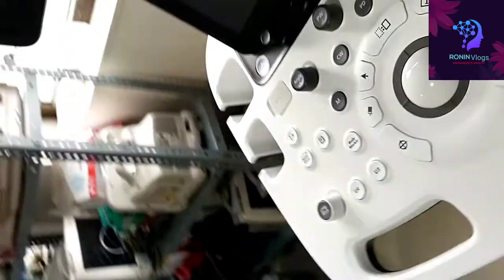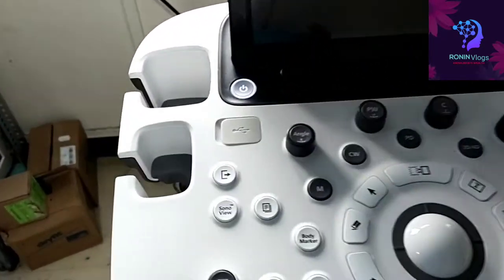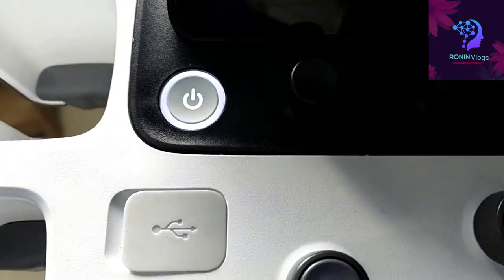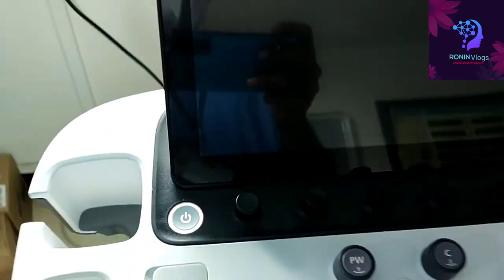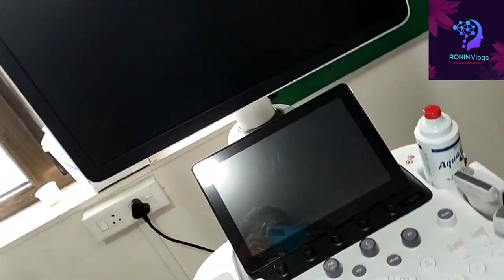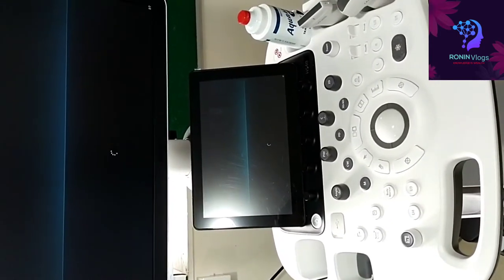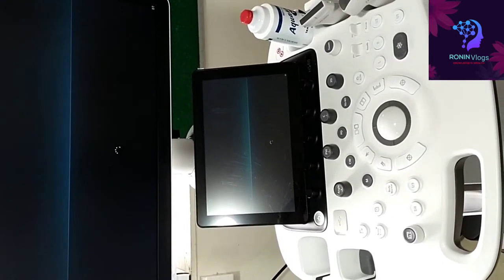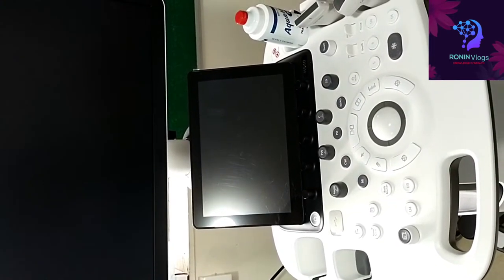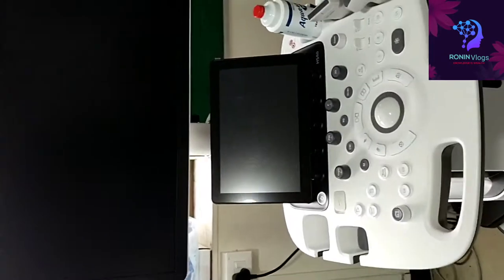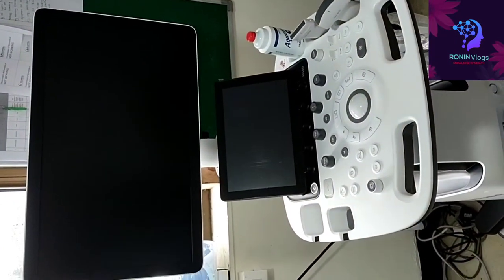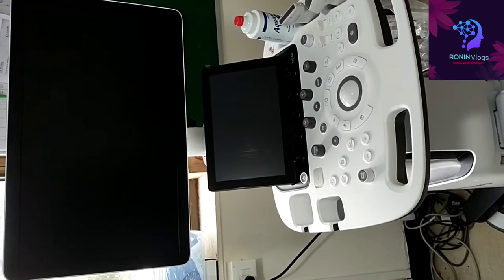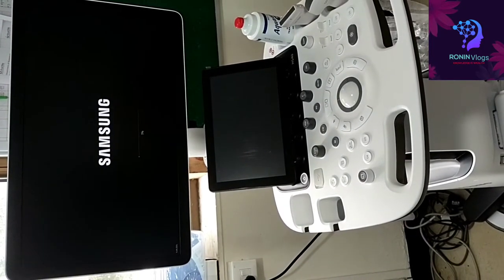Once the power supply is on, the white light glows around the power button. Just need to press it, it will take up to three seconds. The rebooting process is going on.